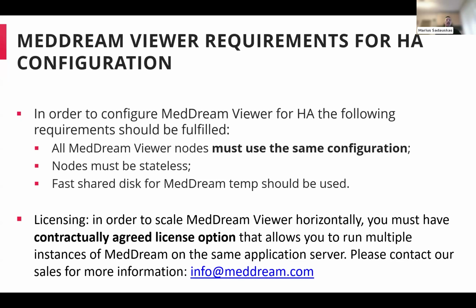And regarding running multiple instances of MedDream with the scaling option, in order to scale MedDream horizontally, you must have contractually agreed license options that allow you to run multiple instances of MedDream Viewer on the same application server.